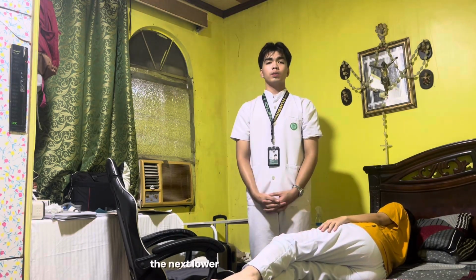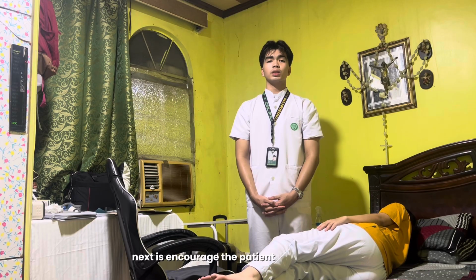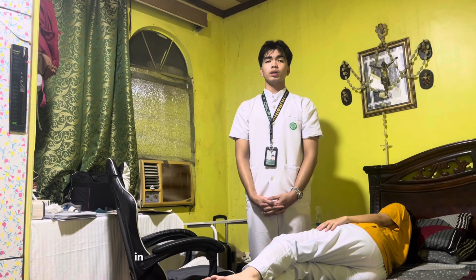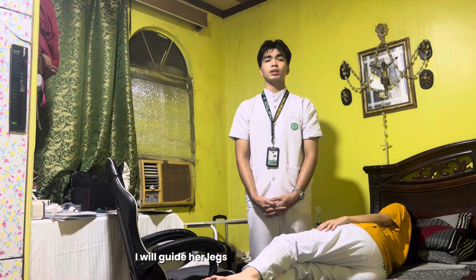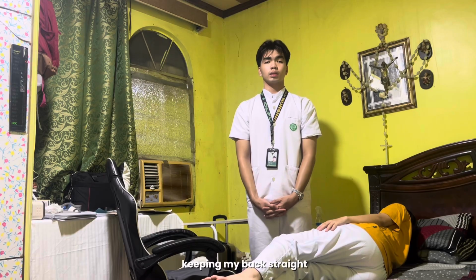Then next, lower the side rail if necessary and stand near the patient's hips with your legs shoulder width apart and one foot slightly in front of the other. Next is encourage the patient to use the stand assist device as you assist them in sitting up on the edge of the bed, if available. However, in this situation, the stand assist device is not available. I will guide her legs over the side while I pivot on the back leg, lift their trunk and shoulders, keeping my back straight.